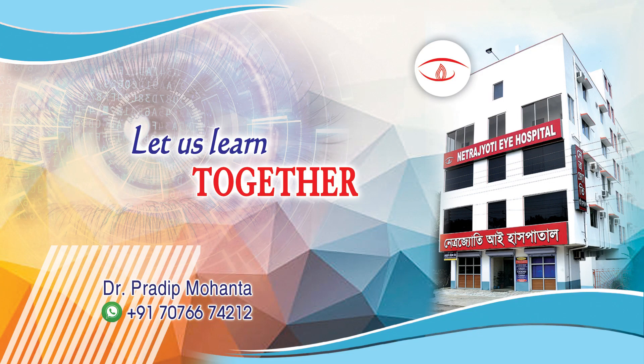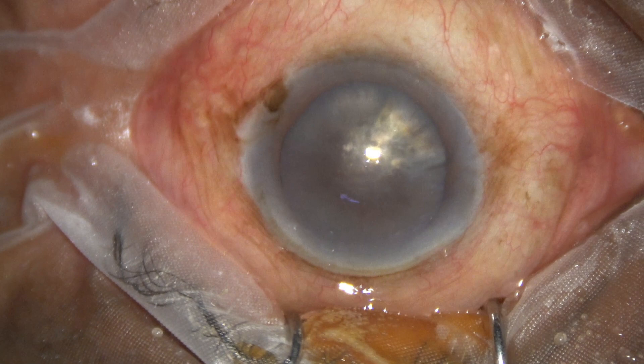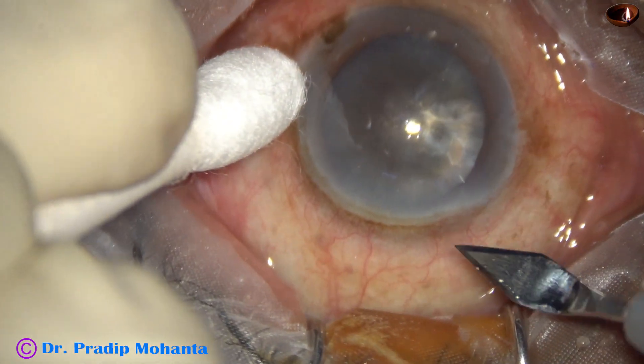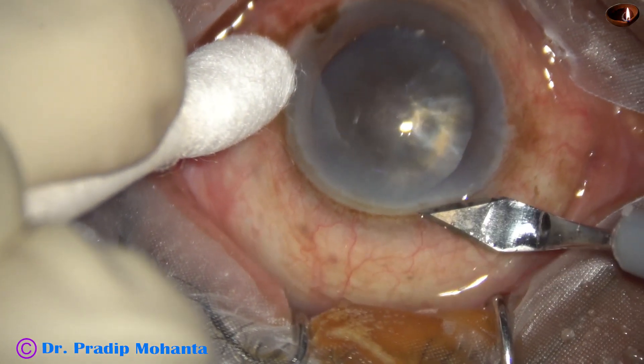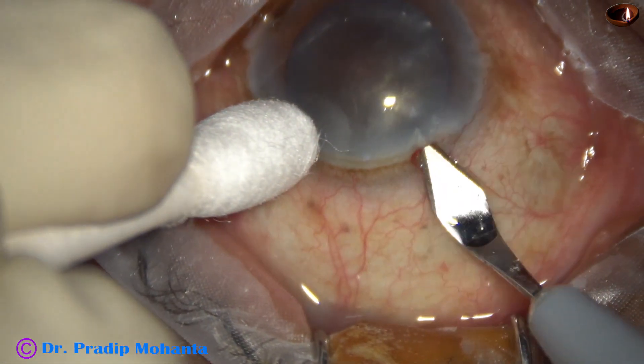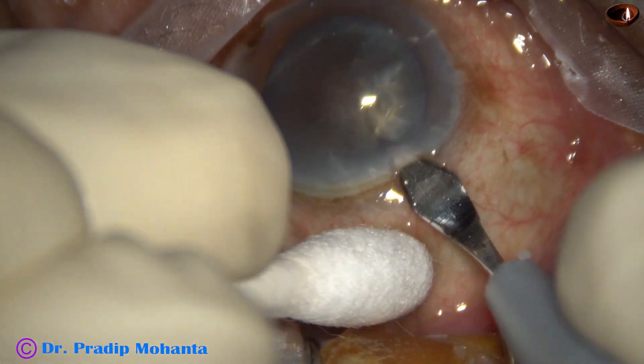Dear colleagues, welcome to my workplace at Ranaghat, West Bengal, India. This is a very hard cataract — nuclear sclerosis is grade 5 or grade 6. The patient is a 97-year-old man with hard-of-hearing. I initially thought of doing SICS, and then I thought, let me try FACO; if it appears very difficult, I will convert to SICS.